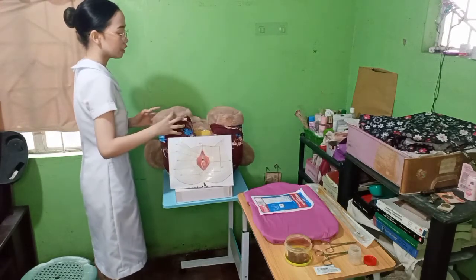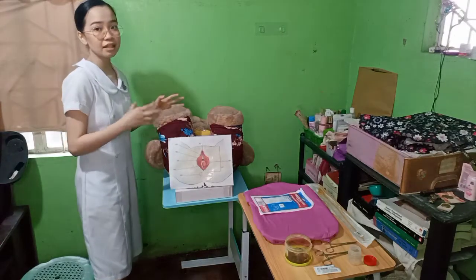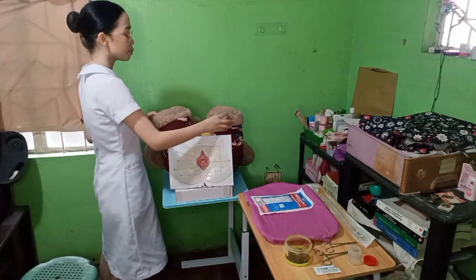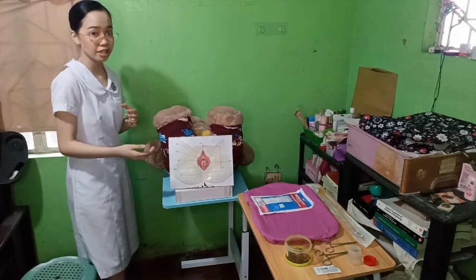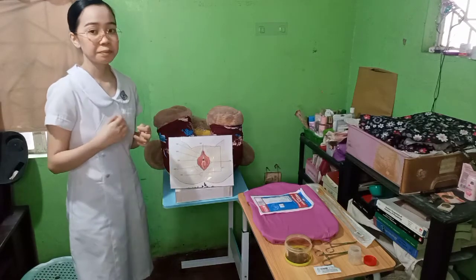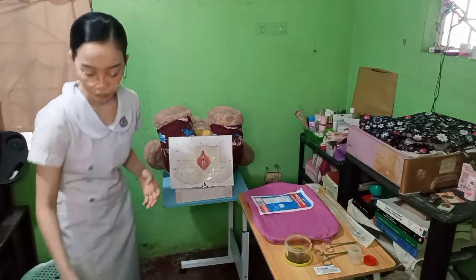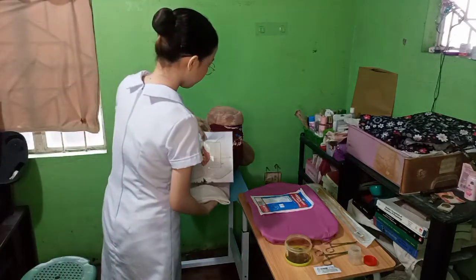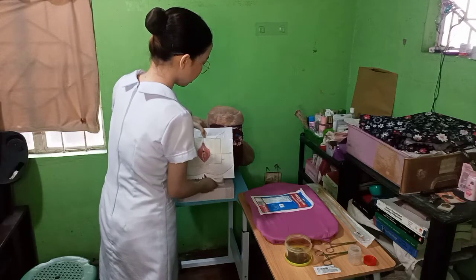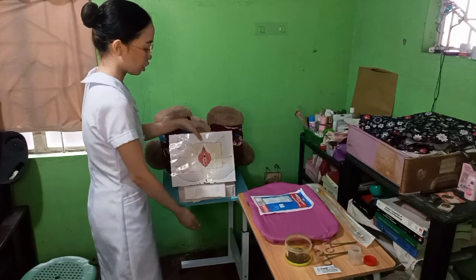In this position, the client is lying on back with the legs flexed 90 degrees at the hips. This position facilitates exposure of the perineal area. And then place Kelly pad under the client's buttocks. Placing a Kelly pad under the client's buttocks facilitates the drainage of all body secretions towards the pail on the floor.